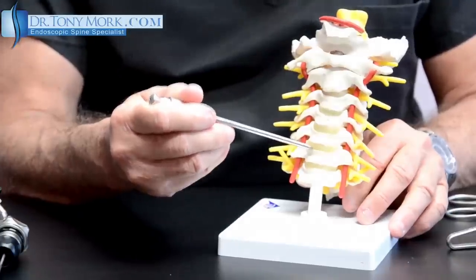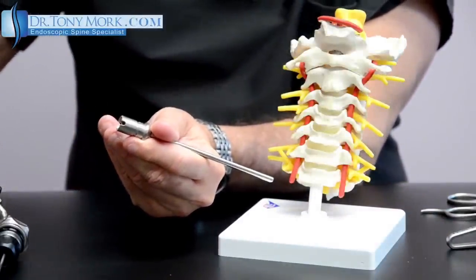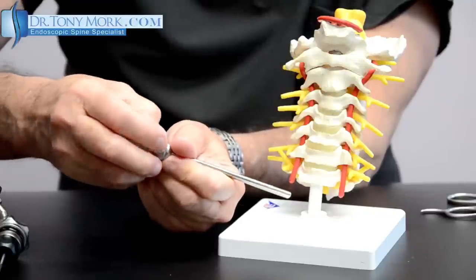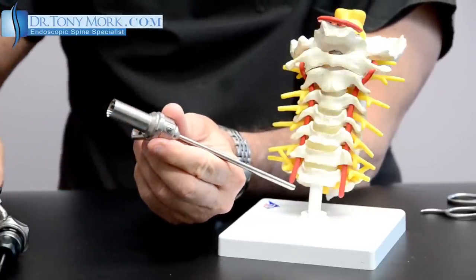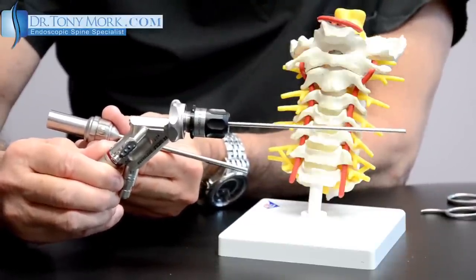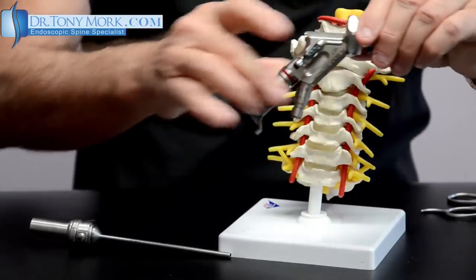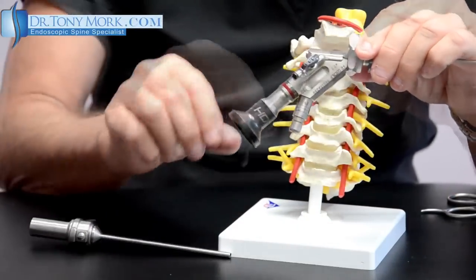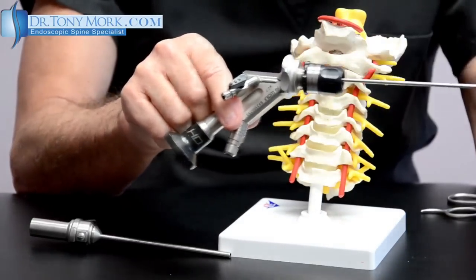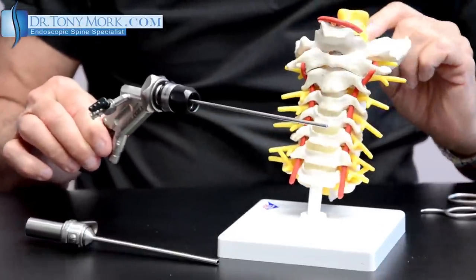Once we have access to the interior of the disc space, this cannula is removed. Then another piece is placed on here so that the scope — and look, it's just a two-millimeter scope with the eyepiece — hooks up to the television camera. This goes off to the TV camera, and then this valve allows a water source. We've got the water source and a light source at the tip, which will allow us to see inside the disc space.